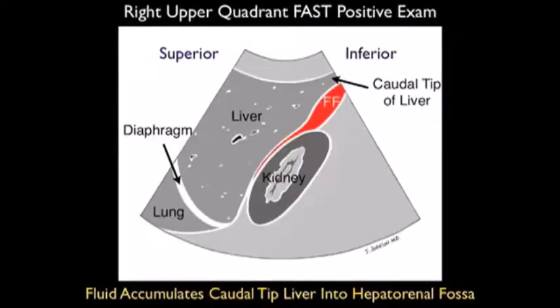Here's a nice illustration showing a positive examination from the Right Upper Quadrant View of the Trauma FAST Exam. We see the liver in the middle of the image, and the kidney slightly posterior and inferior to the liver. The preferential deposition of fluid, shown in orange, layers out predominantly around the caudal tip of the liver, and flows from the caudal tip into that potential space — Morrison's pouch — in between the liver and the kidney.